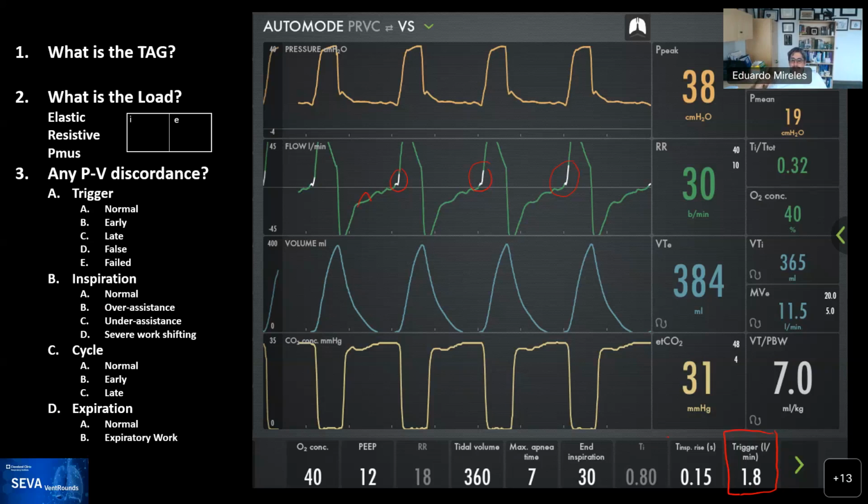Or they start doing other measurements to see if the patient is paralyzed. Because we do not aim at having them fully paralyzed, we use the train of four at times. They see that there's still a sensitivity, and they start going up on the paralytic. Sometimes they reach the conclusion much earlier. I'm just describing a long protracted course in which they finally say, well, maybe it's a false trigger.